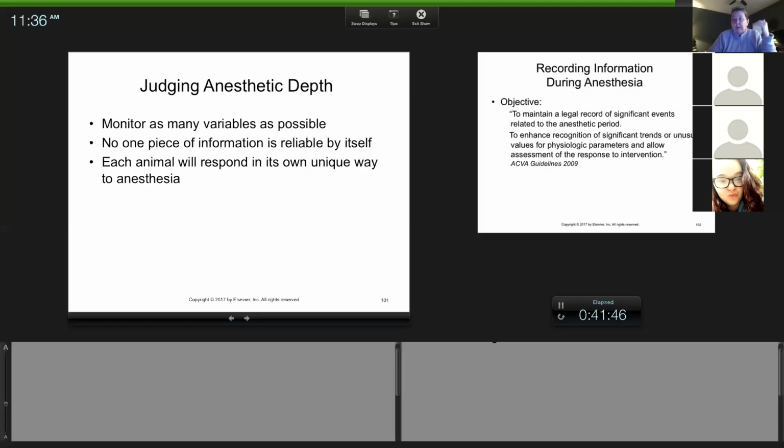Or like heart rate. If it's 120, then 116, then 102, then 96, then 85. Those numbers are more accurate because you have a stethoscope, but the trend is that it's dropping. So when you look at these values, if everything is trending down, either your patient's getting cold or deep. If everything is trending up, respiration going up, blood pressure going up, heart rate going up, well, either my patient's getting light, they're feeling something, they need more pain control. Do you see what I'm talking about?